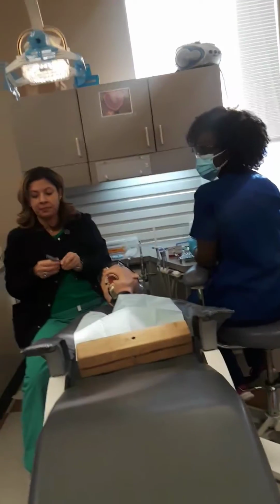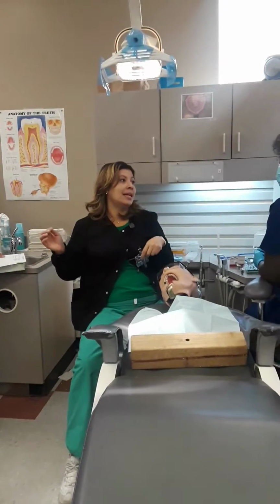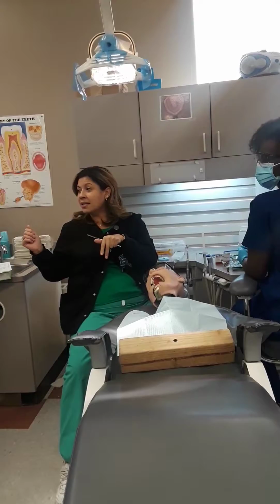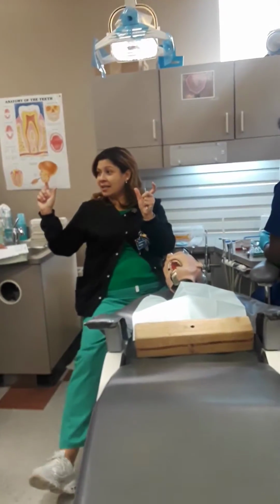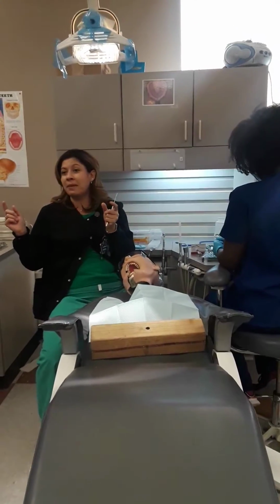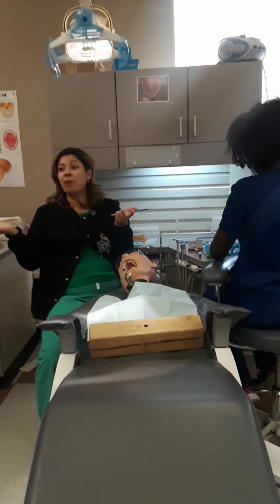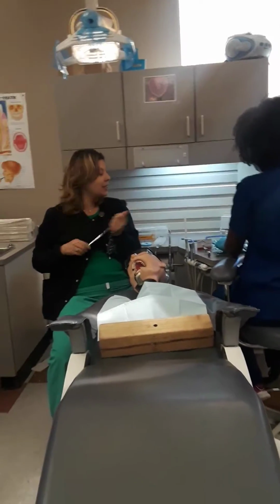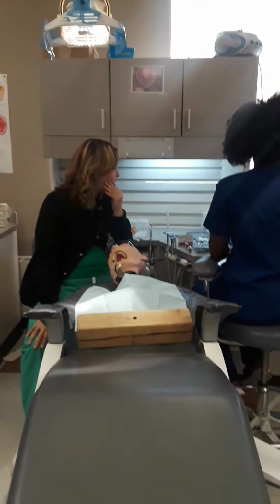It's the second one. Composite placing instrument, it looks just like a Woodson, except this one's black. That's how you know that it is just strictly for composite. Some of those are silver with gold ends or working ends. Those are also going to be an indicator for composite, or it's just going to be plastic. And it looks just like a Woodson, and the proper name is actually plastic instrument, or they call it composite placing instrument, and then a spatula. So those are our instruments.